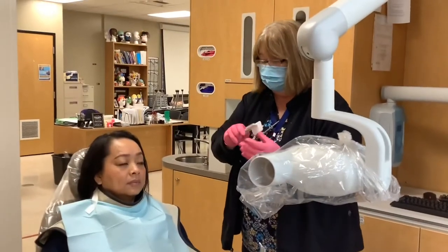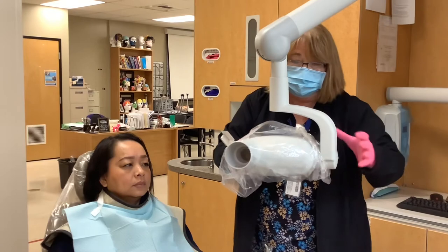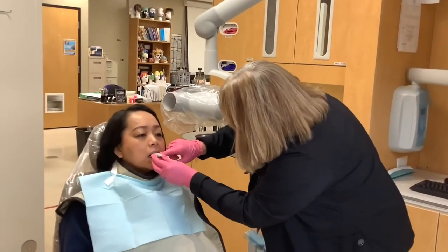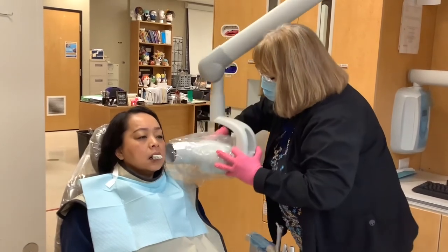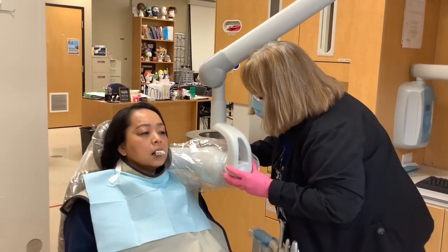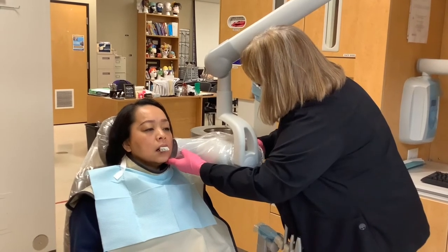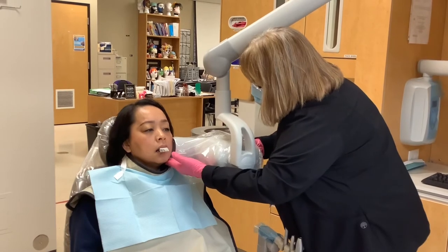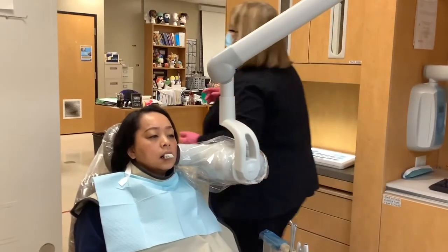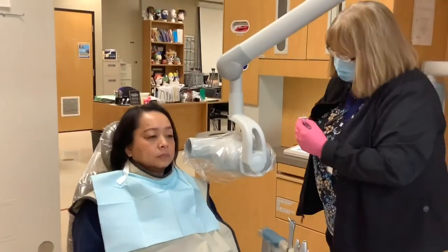Dot in the slot — I'm starting over here on my molars, starting at a negative 5, going to the negative side. I'm going to put this right over my molars and bite down softly. My molars are right here. Bringing it down, the angle of my film is at a diagonal. I like using my hand under my patient's chin so I get the apex of the tooth — if it rests right there, the chin and my cone head angle equally, and I'm not going to cut off my apex.